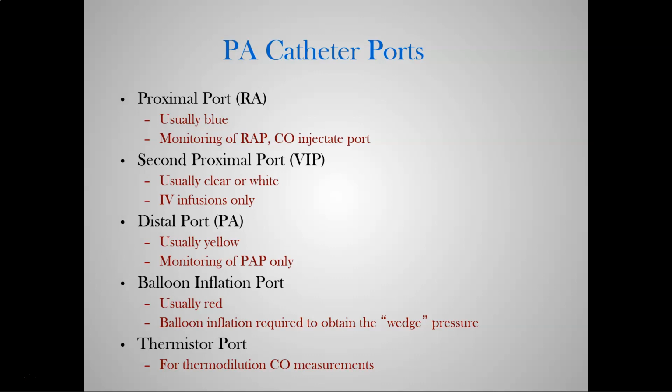That's a big deal. No blood is flowing from the right side of the heart to the artery and into the lung. You are stopping that flow. And we do that, okay, at very specific times or intervals as indicated by your physician or your provider to measure that wedge pressure. And that's the only time we're going to do it. The minute we're done measuring that pressure, that balloon gets deflated instantly. Okay, because otherwise that balloon sits there.